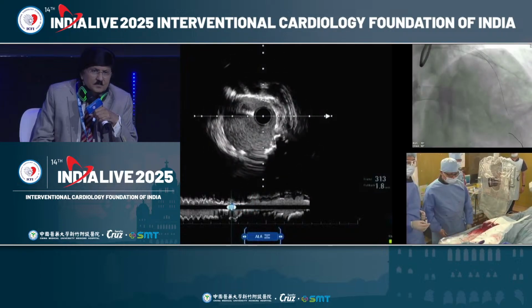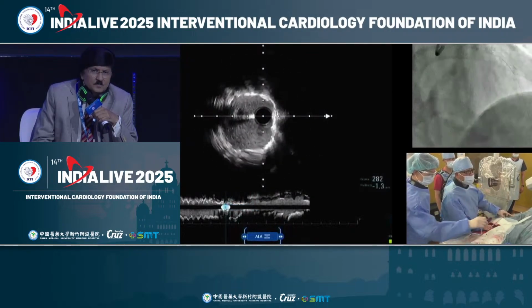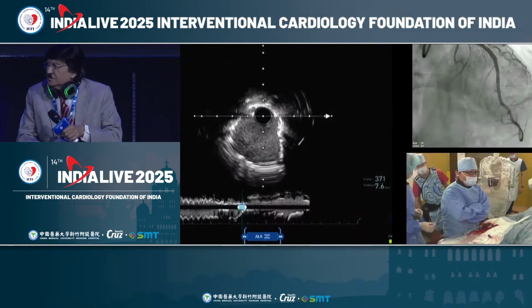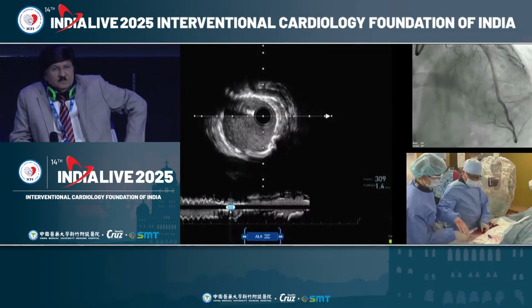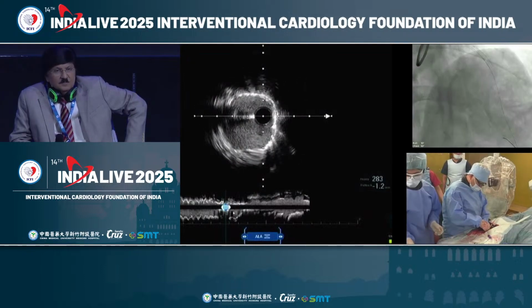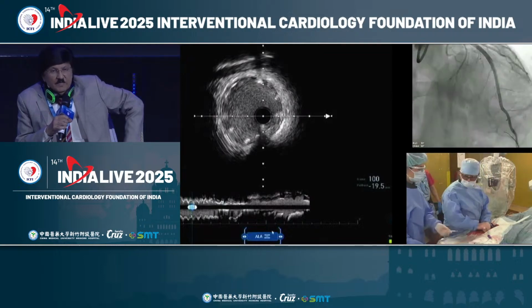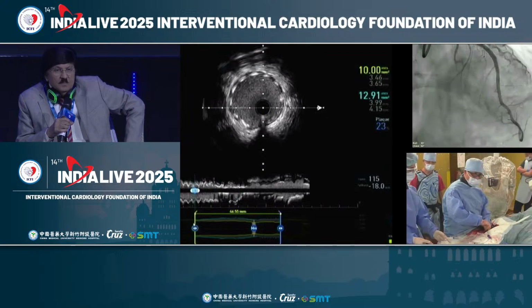And regarding the bifurcation site, it's a little bit difficult to identify, maybe due to the crush part. Yeah, you're right. Just 2 minutes left. And if you can show us the area at the site where it's a bit oblong. Okay, so I will show you the MSA site.